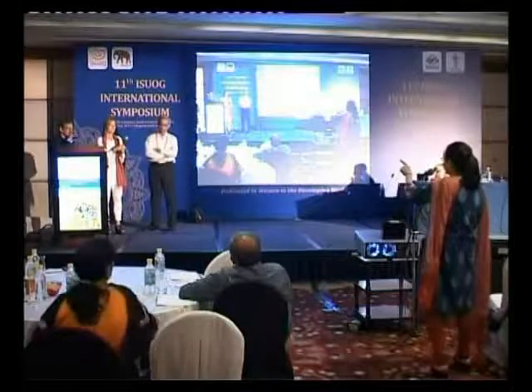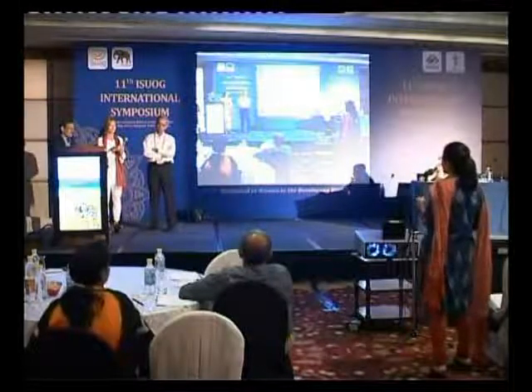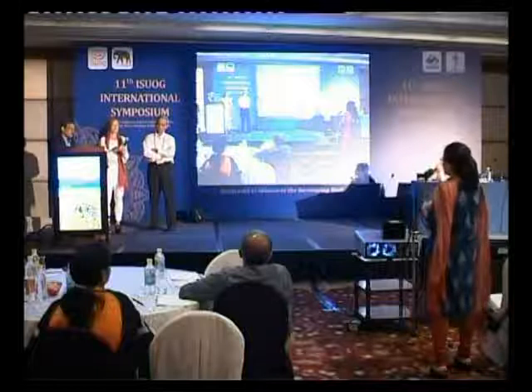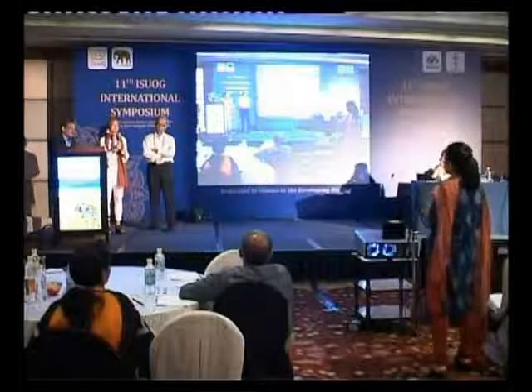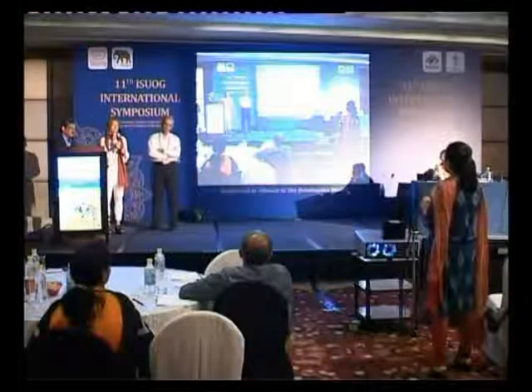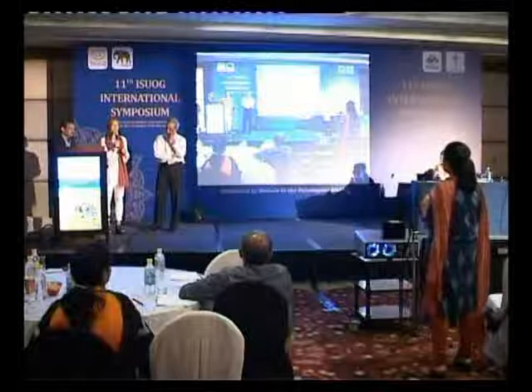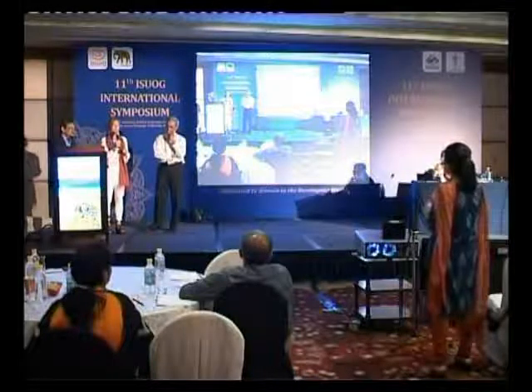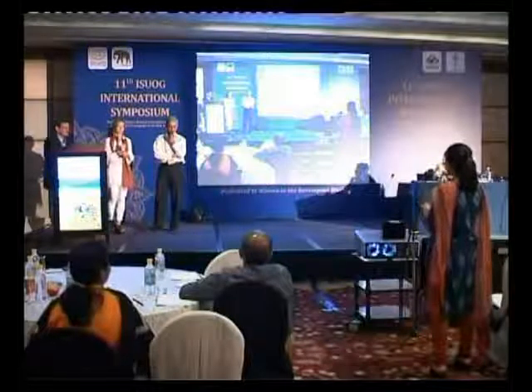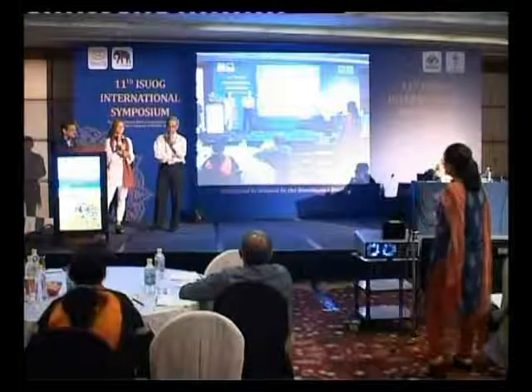Thank you. And I have one thing about contrast. Maybe we are not using it yet. To me it is very similar to what a good Doppler flow study is, other than the flow parameters. And I'm sure it has some advantages. But personally, what I find very challenging is to see early endometrial carcinoma in a mid-position uterus. I think that is where contrast will help us more than anywhere else, because it is impossible to see a close-up. On transabdominal, you can see the endometrium, but on transvaginal scan in a mid-position uterus, I think contrast will help a lot in picking up early malignancies.